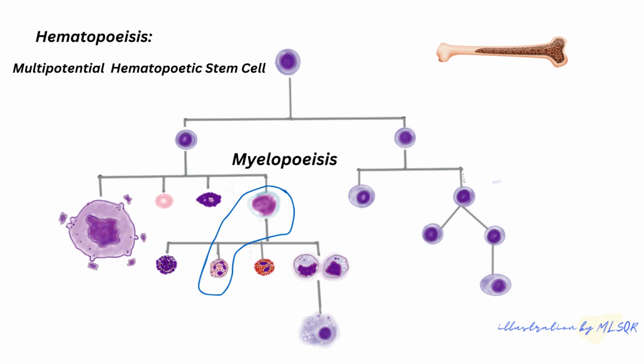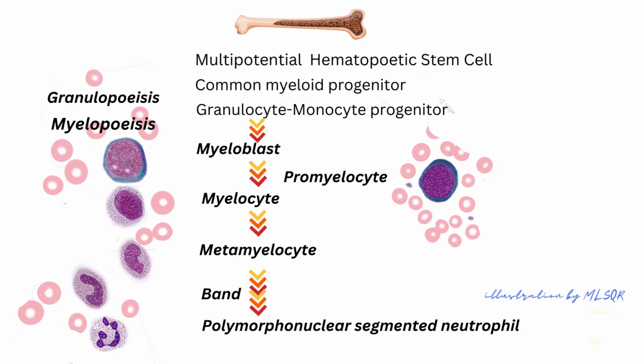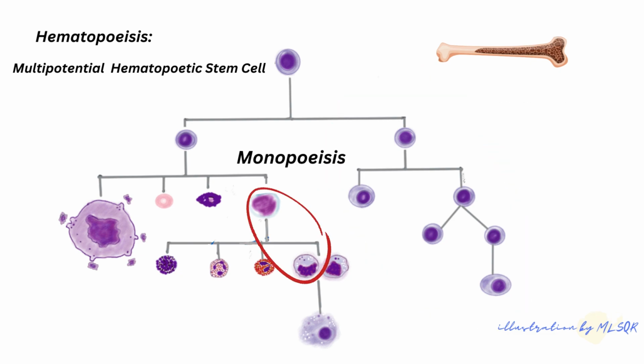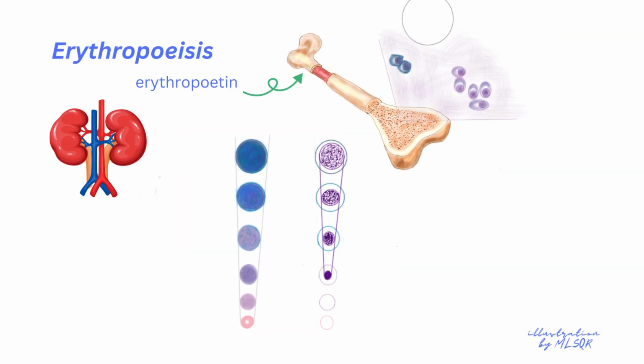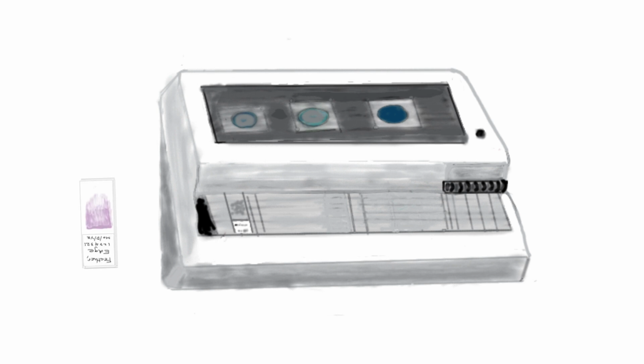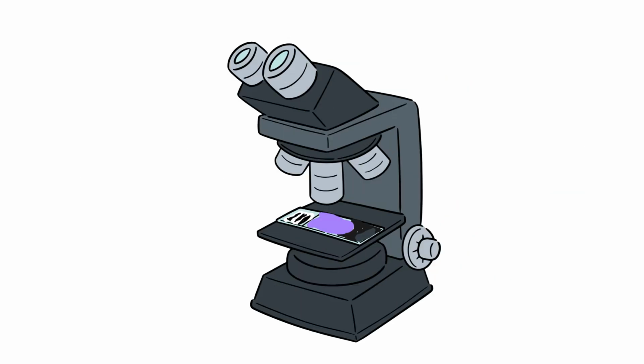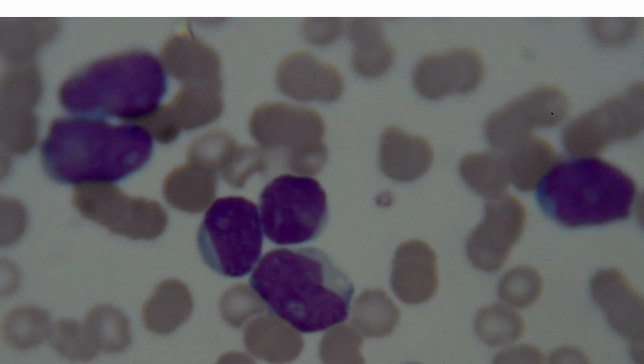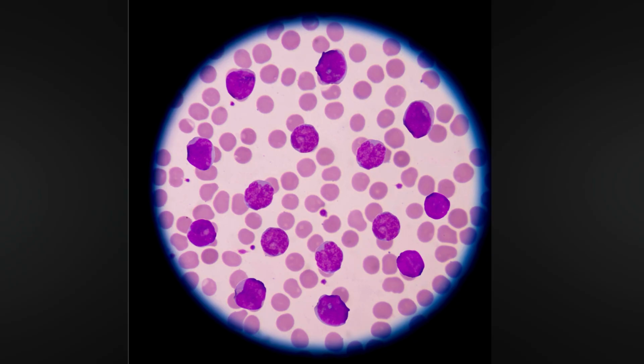Hematopoiesis that we will be referring to, but not in any detail, includes myelopoiesis, lymphopoiesis, monopoiesis, erythropoiesis. Blasts possess certain identifiable characteristics, but they are also present in many different sizes, shapes, colors, and forms.